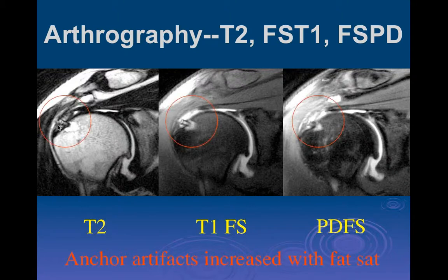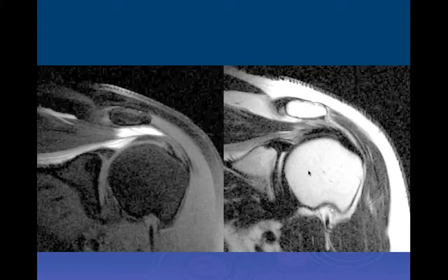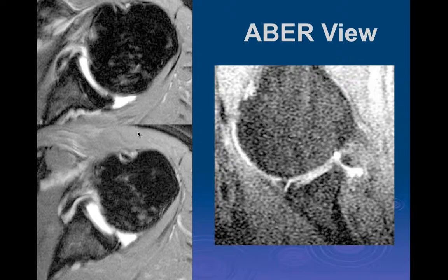Okay, so that just shows what I think is the importance of having the non-fat suppressed T2 weighted image in evaluating the postoperative shoulder. This shows a patient who was injected with contrast, and there's a subacromial injection. We saw an abnormal injection earlier, so the contrast is not in the proper location here. It's not in the joint space, but in the subacromial space. And here's an injection within the supraspinatus muscle and tendon, which is also not a good place to inject the shoulder. Just showing abnormal injection patterns.